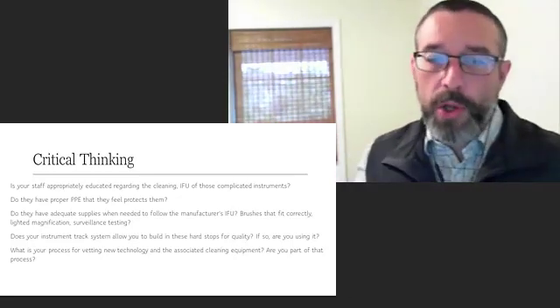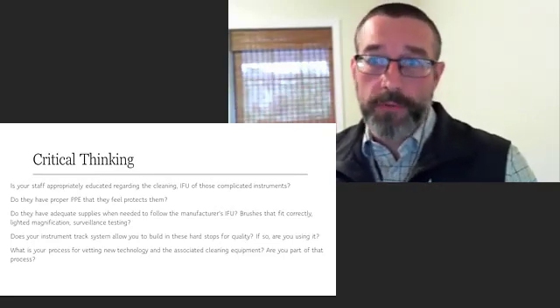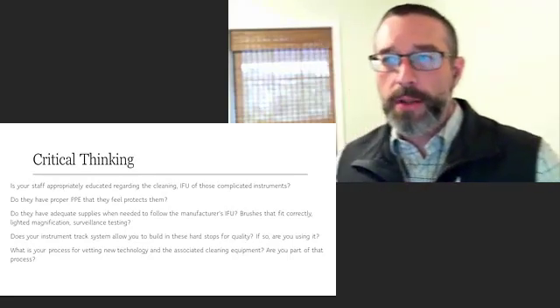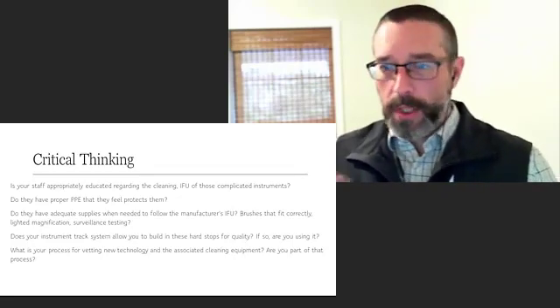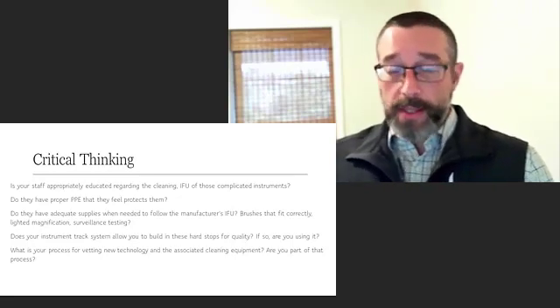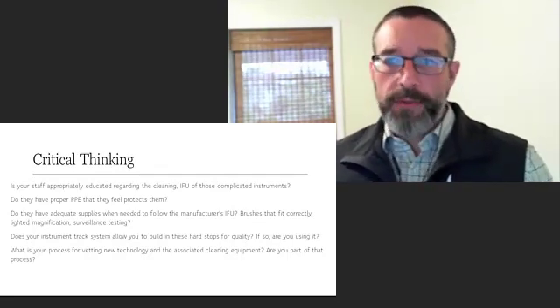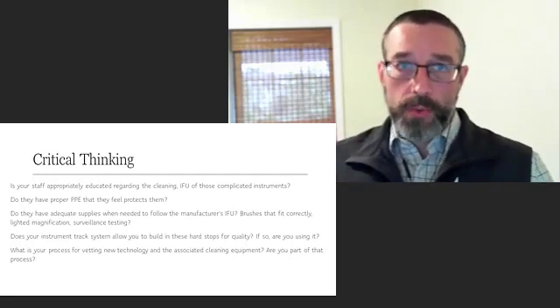So to close this off, these are some of the questions that we're asking ourselves and you should be asking yourself, critically thinking about and risk assessing what you're going to do. Is your staff appropriately educated regarding the cleaning IFU of instruments, old and new? Are we ready for that? Do you have the proper PPE to feel like they're protected? That's, of course, critical right now, as we talked about. Do they have adequate supplies when needed to follow the manufacturer's IFU: brushes, light and magnification, surveillance testing? With just-in-time ordering as something that we mentioned, are you ready now?